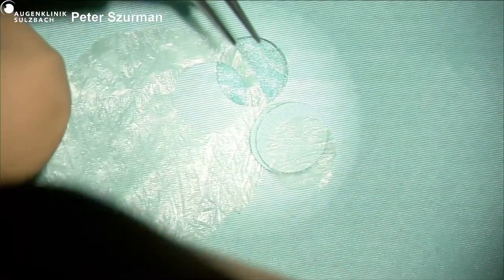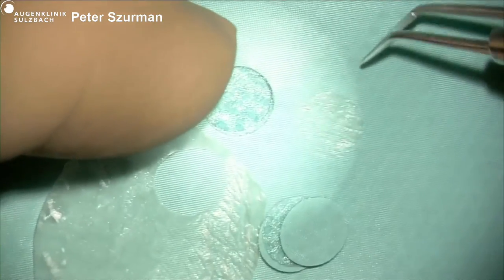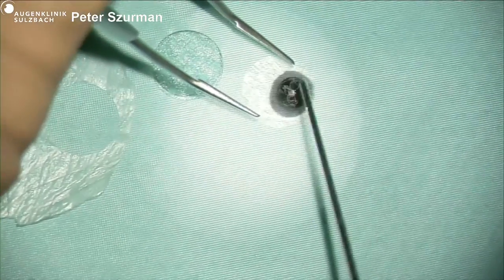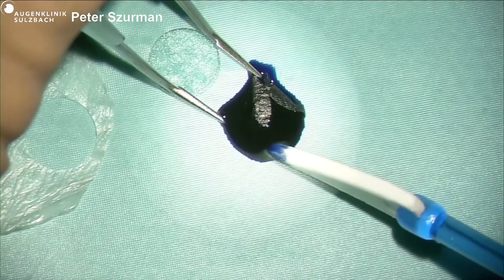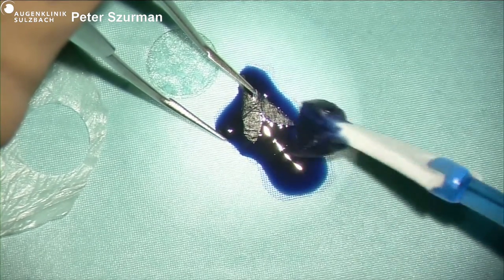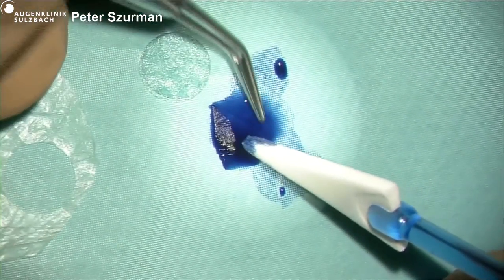Which size is it, Peter? It's 6 millimeters. So it's a quite large patch which overlies the total macula. And we will stain it. Basically, it's a similar technique like the DMEK, so a perfect translational technique from other disciplines. Here we don't stain the Descemet membrane, but the epiretinal amniotic patch, just to visualize it. And in 2 minutes we will implant it.